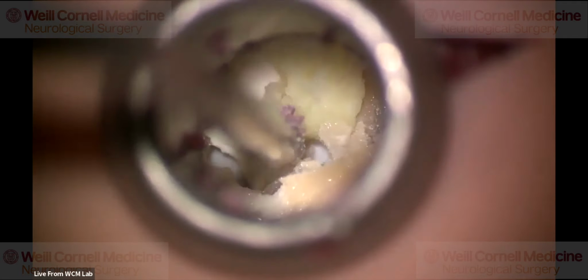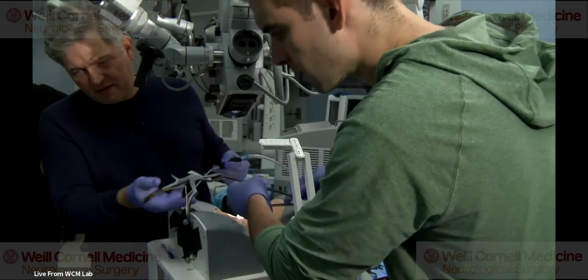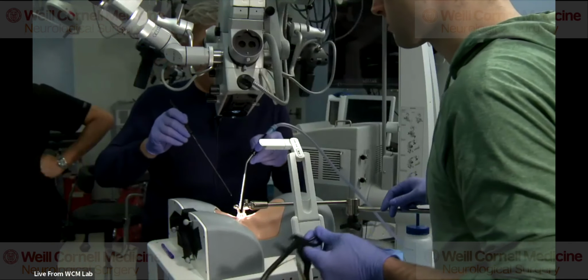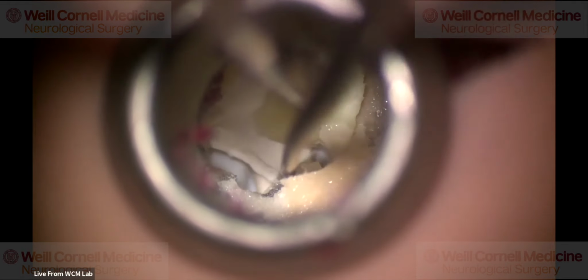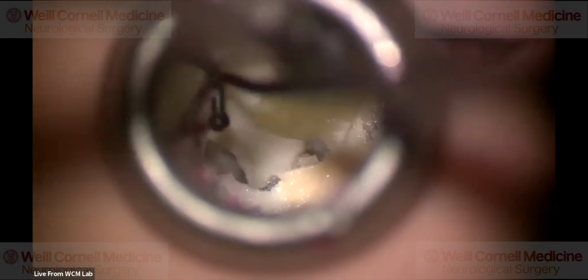I feel it. If you have the ball tip, the ball tip is here. So now I found my first landmark for the nerve root. That's the cranial pedicle here. You see how smooth that is? That's the inferior medial edge of the C4 pedicle.